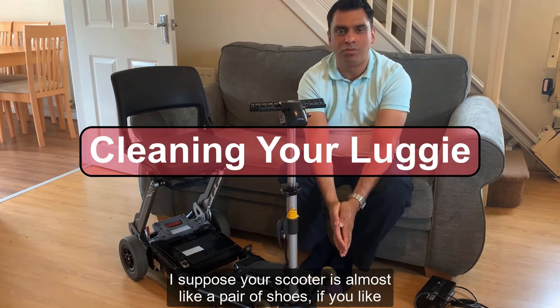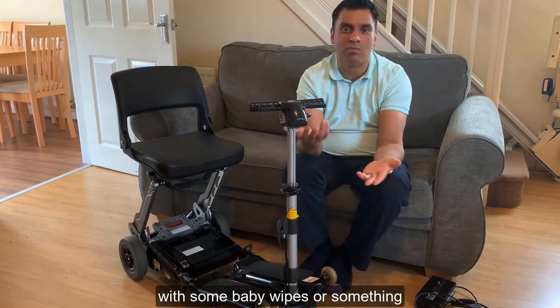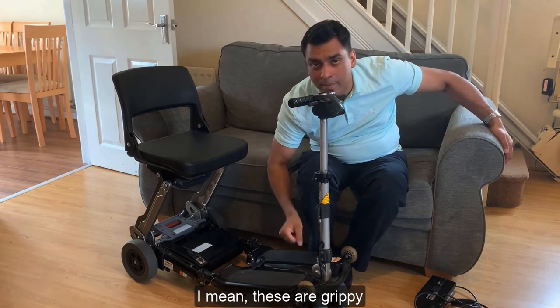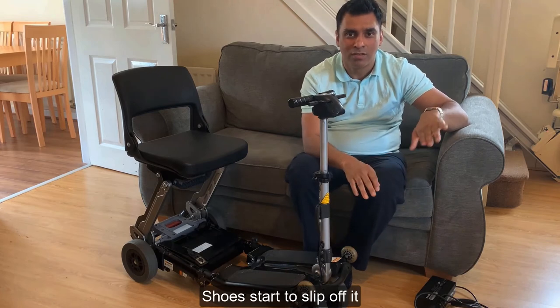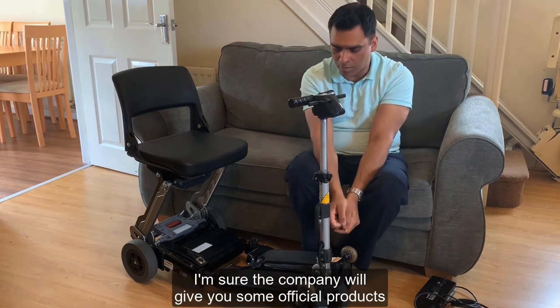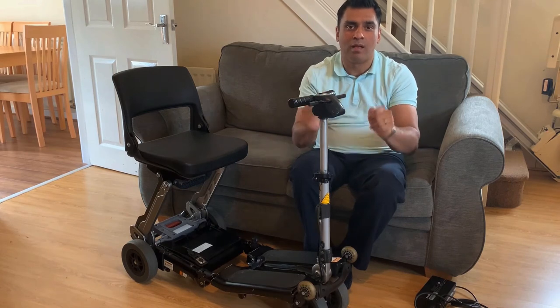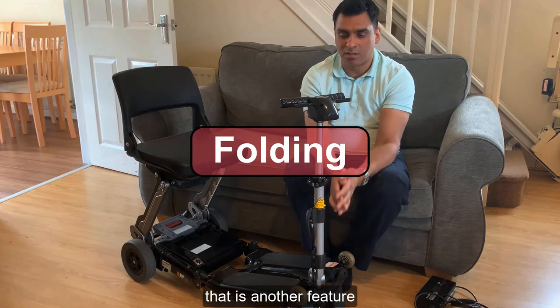Cleaning your Luggy - it's almost like a pair of shoes, it should look nice. I use baby wipes to give it a clean. However, one important thing: don't clean the foot grip patches with any soap, detergent, or even a baby wipe, because it makes them slippery and your shoes start to slide off. You can wipe the foot patches with water only, but no cleansing liquid. For the rest of the scooter, baby wipes work fine.